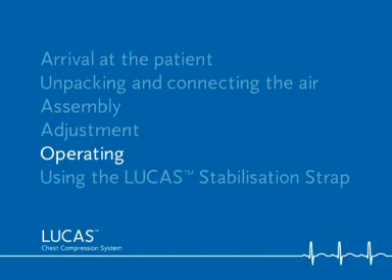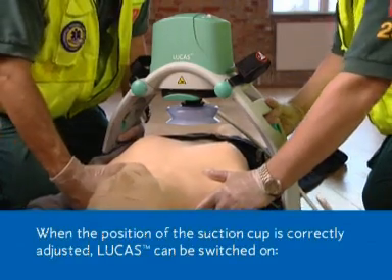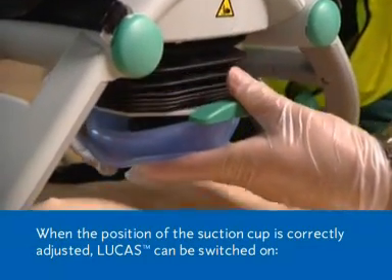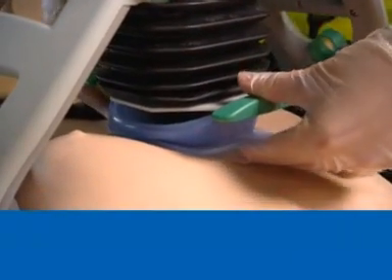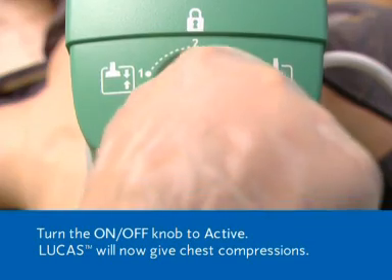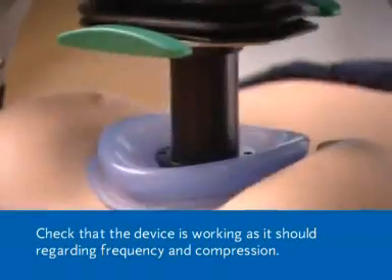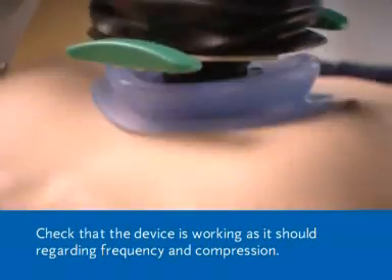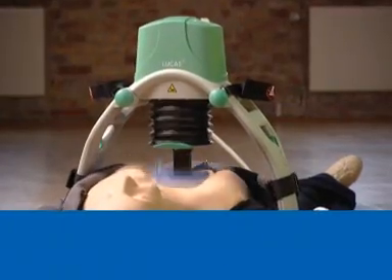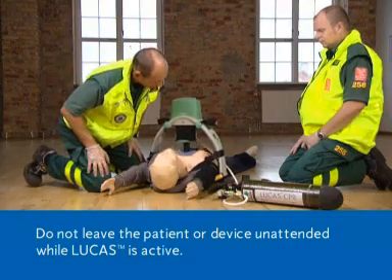Operating. When the position of the suction cup is correctly adjusted, Lucas can be switched on. Turn the on-off knob to active. Lucas will now give chest compressions. Check that the device is working as it should regarding frequency and compression. Do not leave the patient or device unattended while Lucas is active.